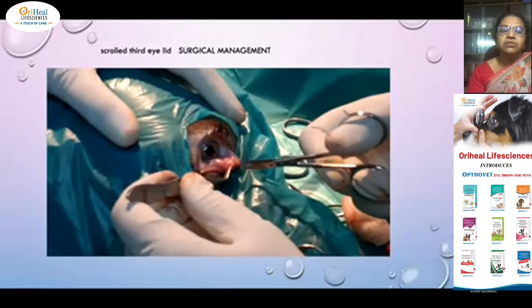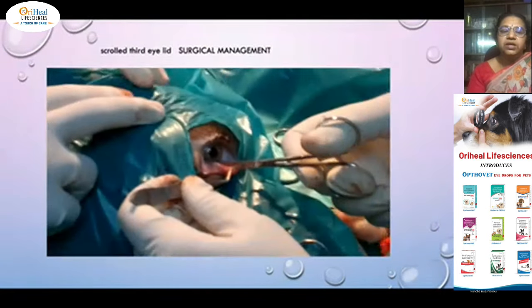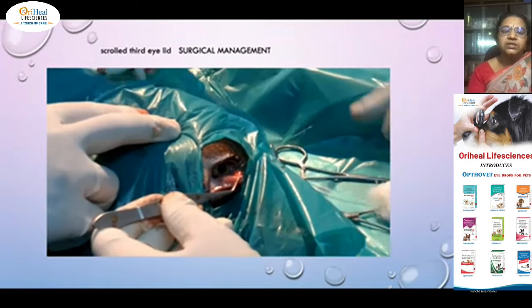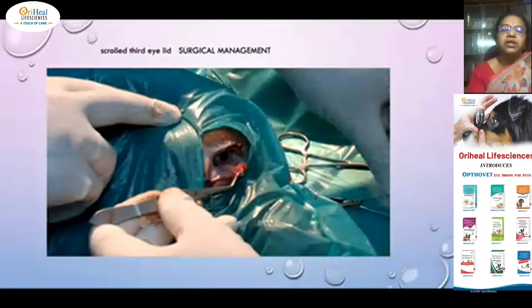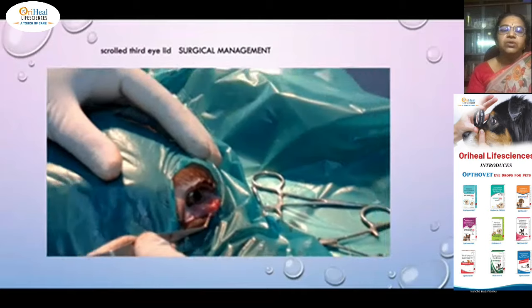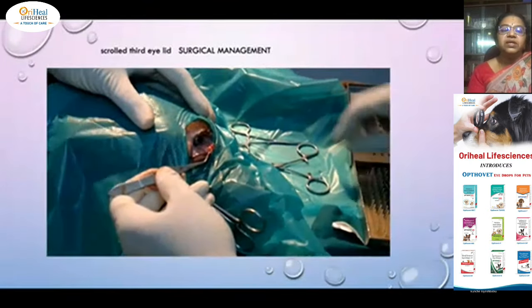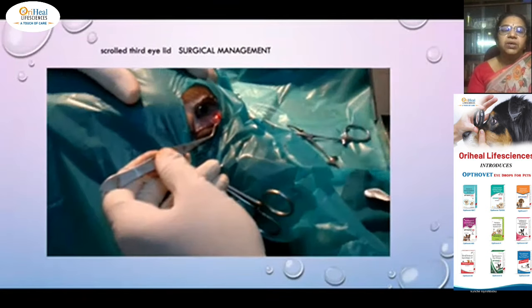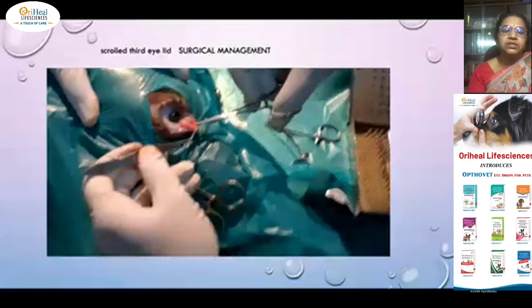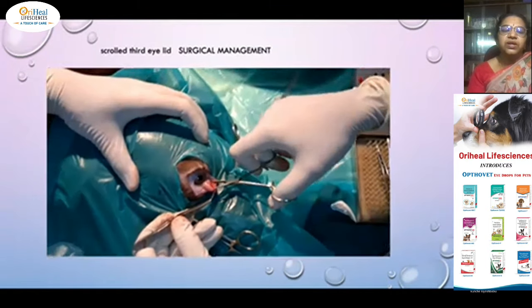conjunctiva, the palpebral conjunctiva, can be cut on the third eyelid, and you are slowly trying to reflect the cartilage. You will be able to delineate the cartilage well because of its coloration. It will be more white in color when you go down further. Hence, you will be able to identify it better, because though bleeding is there, initially you will have some difficulty, but with the help of blunt dissection, after putting an incision, try to make some blunt dissection with the help of the artery forceps and go further down.